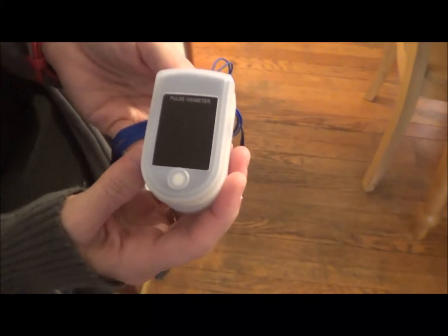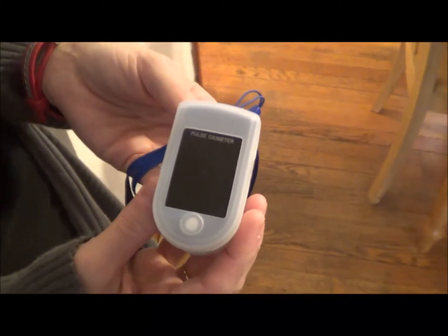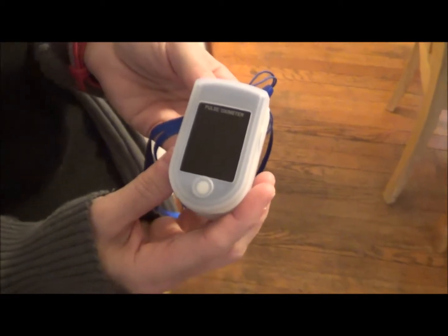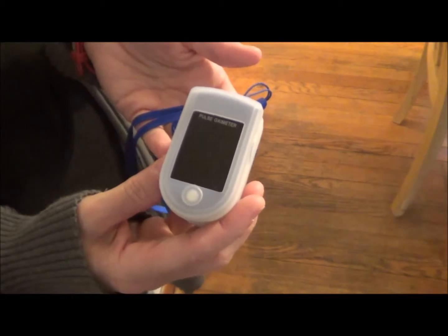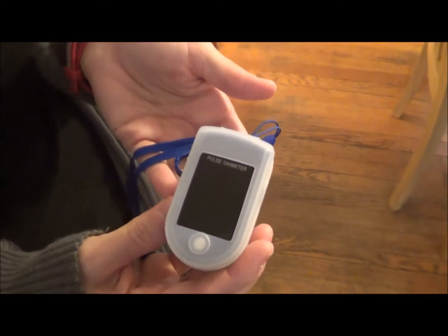This is the Finger Pulse Oximeter from Anovo. It measures your SpO2 levels, which are basically the amount of oxygen saturation you have in your blood — just the amount of oxygen in your blood.